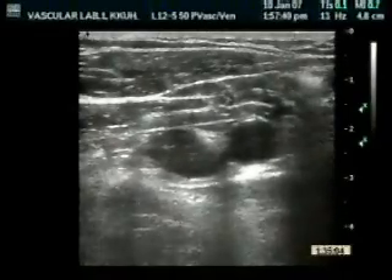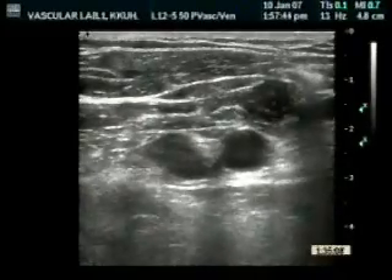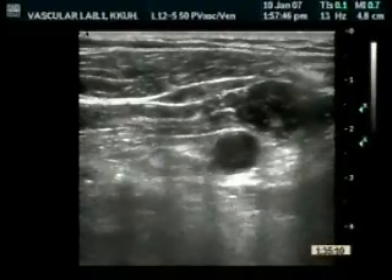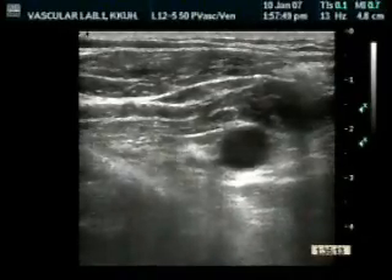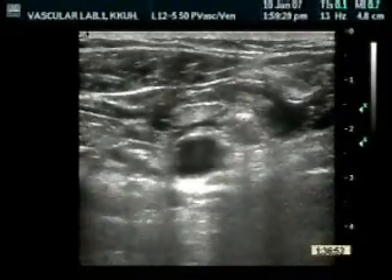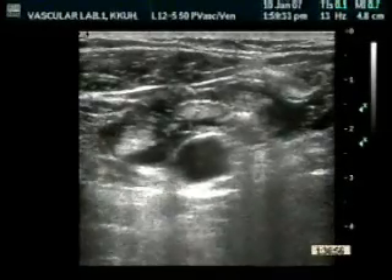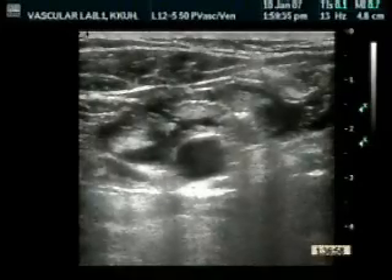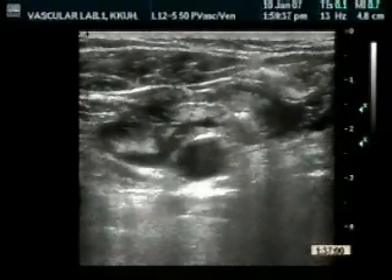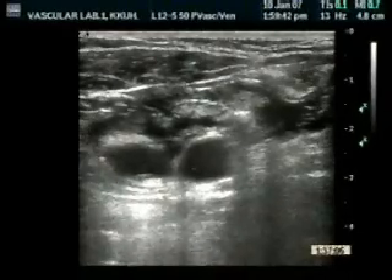You can see the needle now entering, and you can see the injection made just to assess where the needle is. We are trying to block the lateral cord. You can see the needle again entering at the two o'clock position. This is the injection for the medial cord — you can see the solution surrounding it.